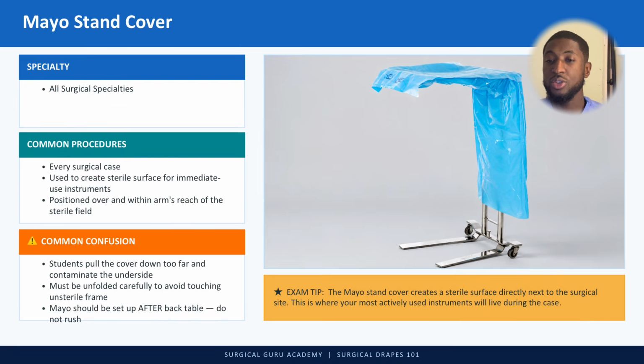Common confusion: the student pulls the cover down too far and contaminates the underside. You've got to be careful when draping it to not contaminate it. It must be unfolded carefully to avoid touching the unsterile frame. Absolutely. And Mayo should be set up after the back table. Do not rush.